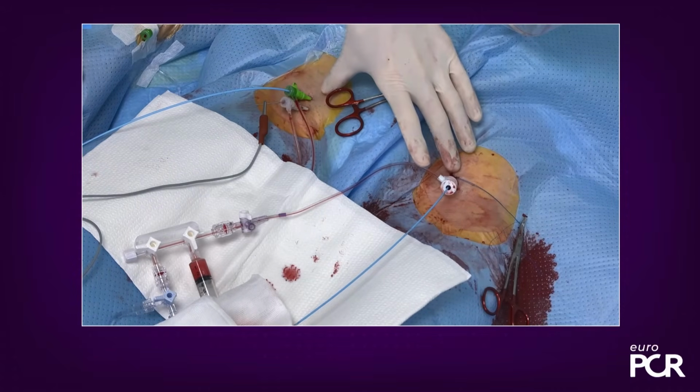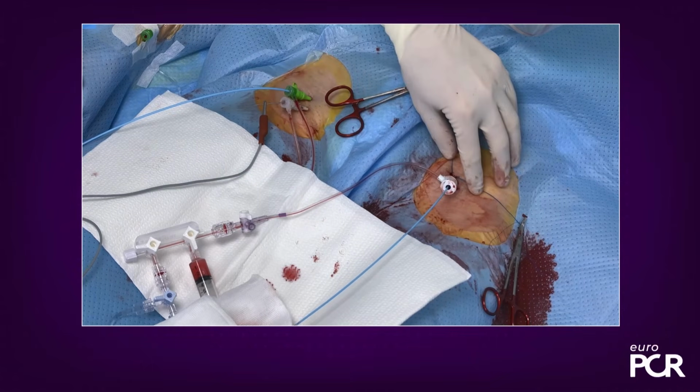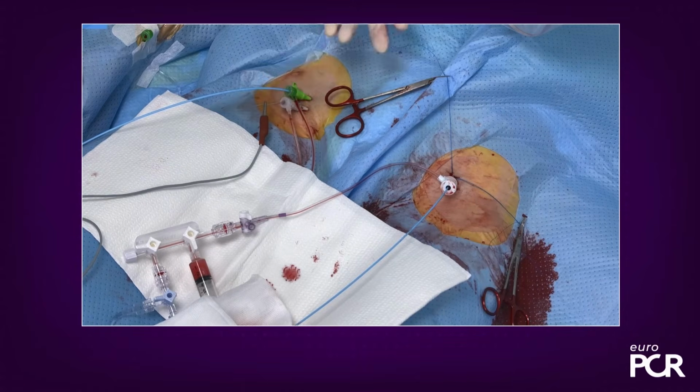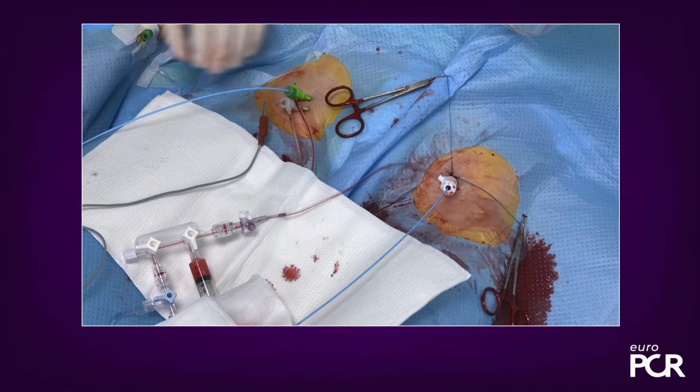And then we have 2 arterial accesses, one for the TAVI site on the left, where the 2 ProGlides have been deployed now, and then we're soon going to introduce the eSheath. And then we have a 6 French for the pigtail and a venous access for either a temporary pacing wire or, as we will explain later, for temporary pacing on the small wire.